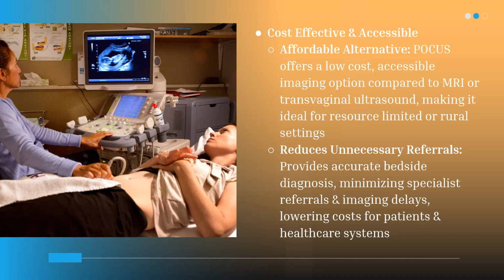The other thing that's really important is that bedside ultrasounds are far more cost effective than sending them to ultrasound. You've got a lot of extra steps. You've got a whole department you have to manage with staff and a radiologist that has to read it, and it takes a lot of time, versus a clinician being able to do a focused point-of-care ultrasound, which is so much better. We can reduce a lot of unnecessary referrals when we can get our information and determine the next steps quickly, and then send them to the next person in the specialty line that needs to continue the care based on the results you find.